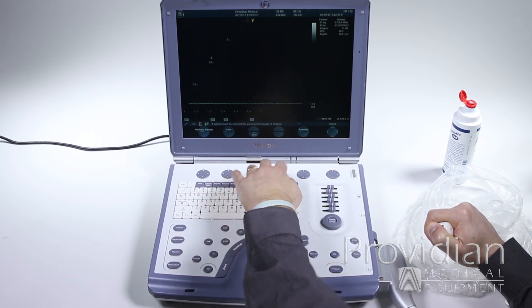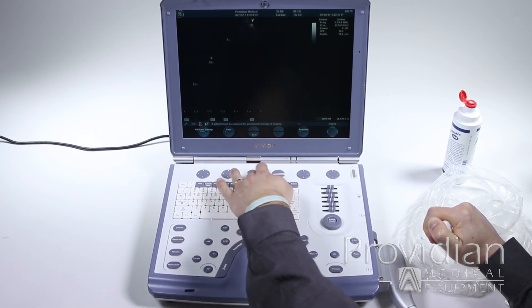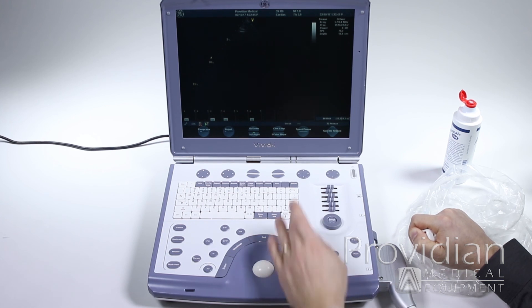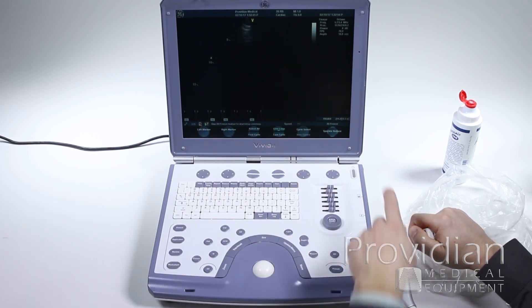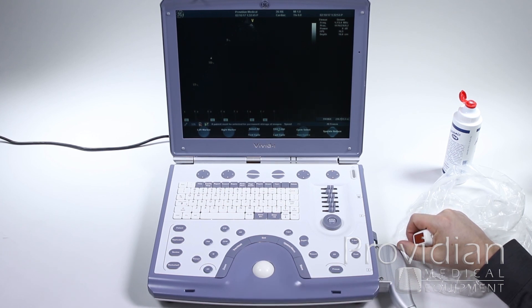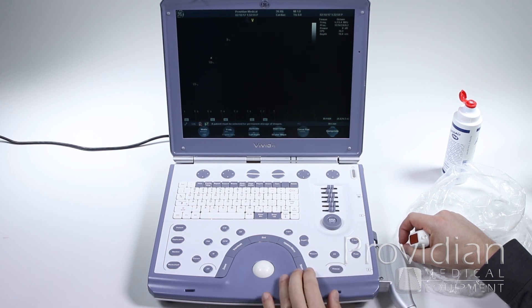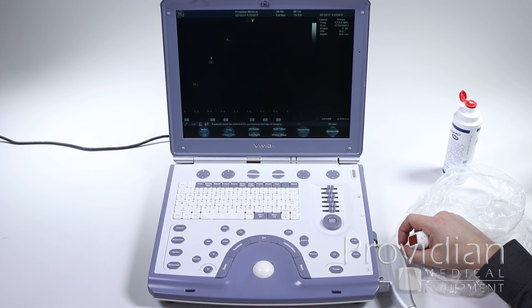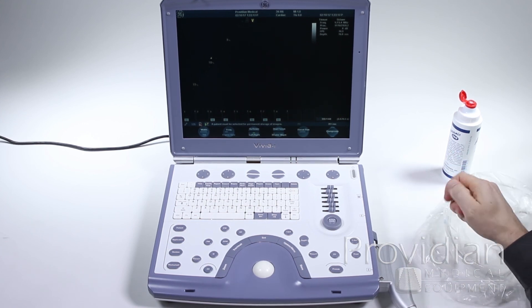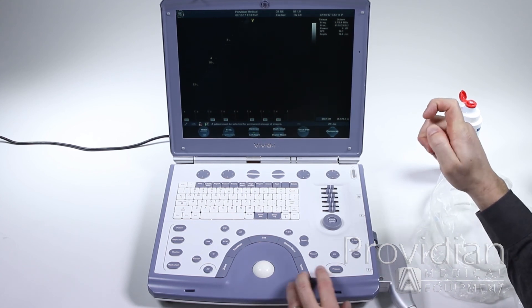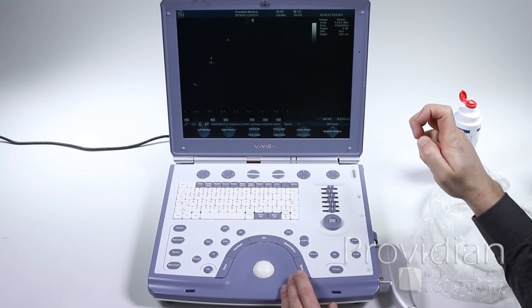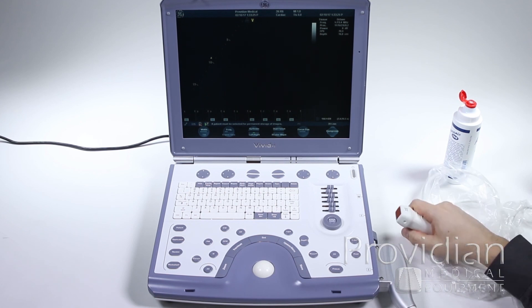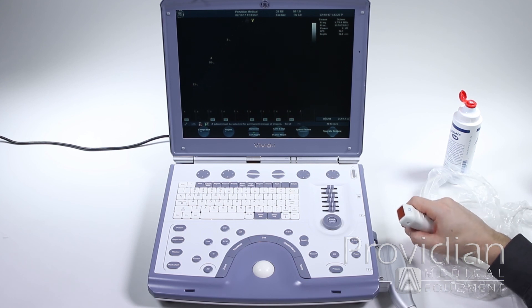If I turn the ECG off and then I've got a live image, and then I hit store, if I play this cine loop, you can't really tell, but it is playing, it shows right here that it is playing. Then I hit store, it's going to save that entire cine loop, not just a portion of it. Same thing with a live image, I can hit store and then press store again, and it's going to save that loop. So that's what's called prospective saving. It's almost like working a VCR. So if there's no ECG hooked up, I can go ahead, go with this live image, press store, and it's saving everything I see right now. I press store again, and it saved everything that I just watched in that live image. Hopefully that makes sense.